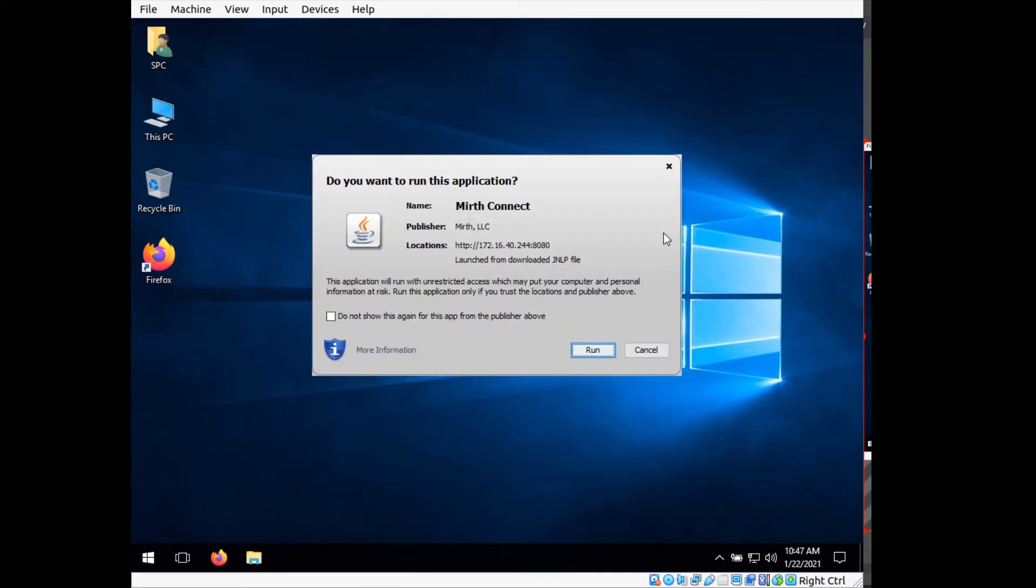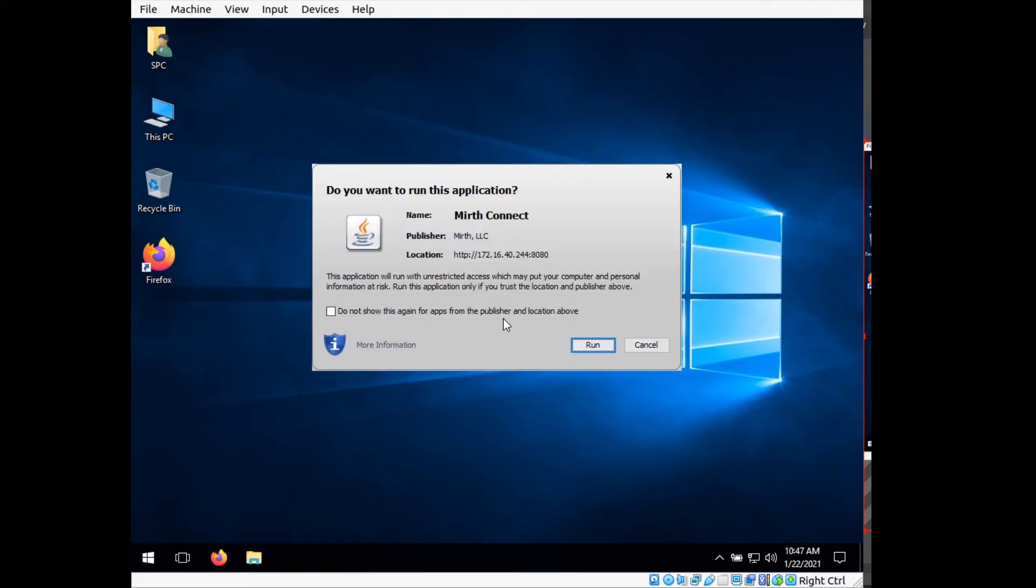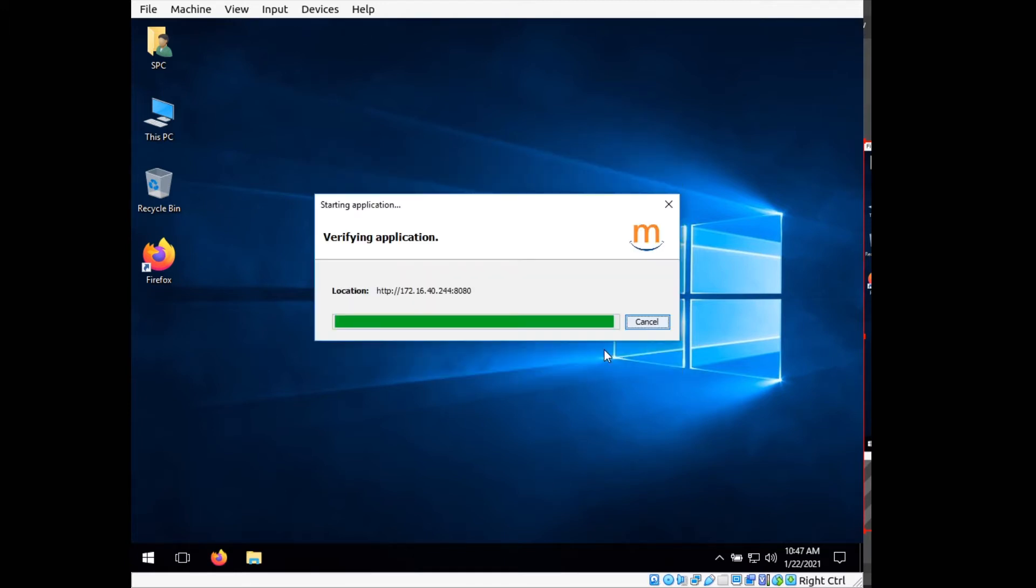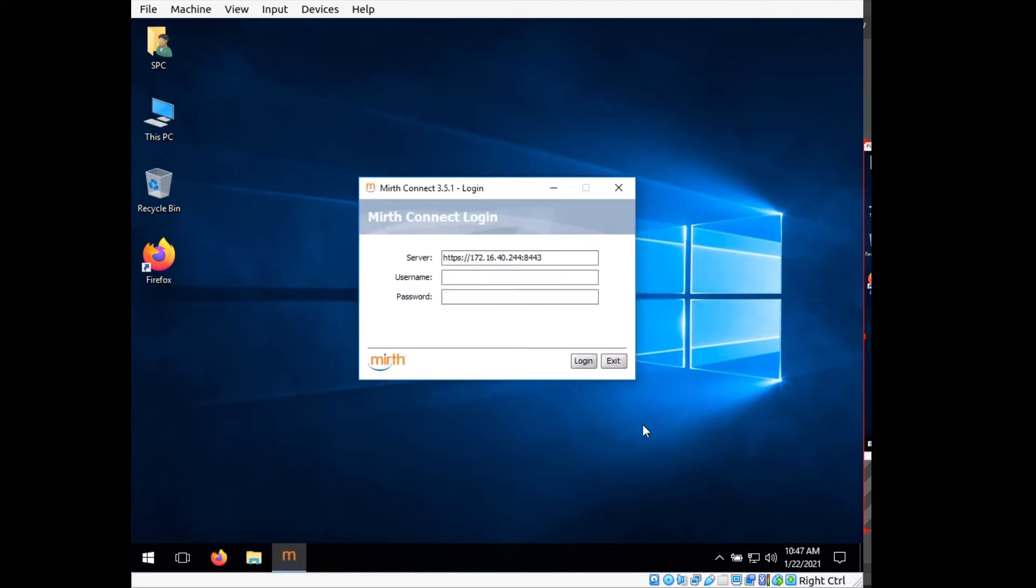And it will start loading the Mirth Connect software on Windows. Now for this, we just want to go ahead and run it. You can select trust if you want to. For this, I'm going to do that just so it doesn't keep popping up. Do it for the other one as well. And now it will start the web app.